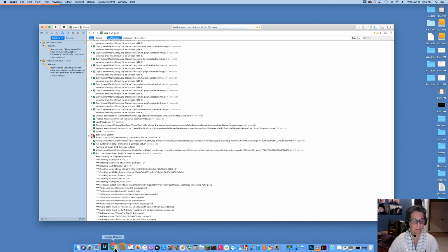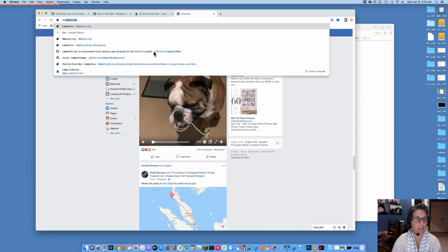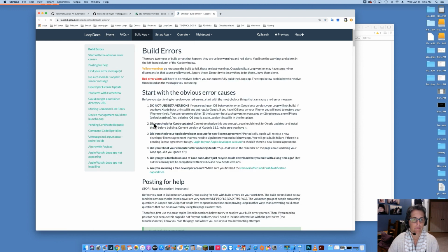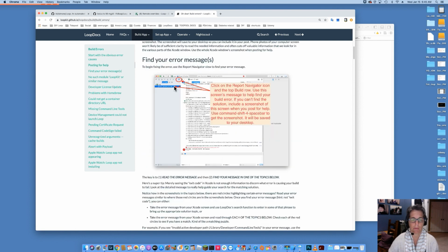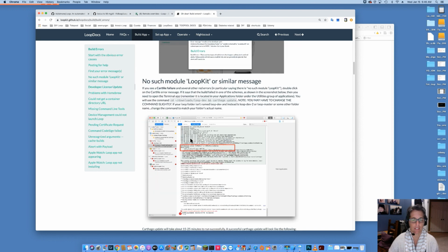And so where'd you go for that? I'm going to just pull this over. There's Facebook. Look at that. So let's go to Loop Docs, and we go to the build errors page, and very easily what you do is you want to still be on that report navigator tab. So keep that report navigator tab and read the error message. All of these screenshots are from that report navigator.